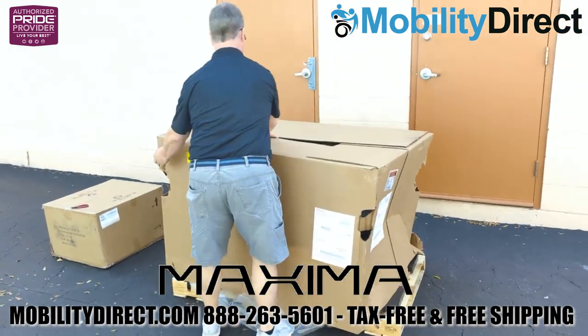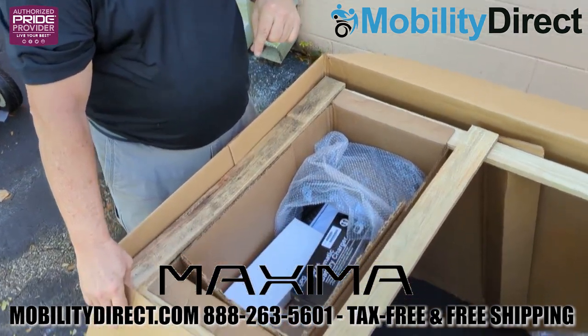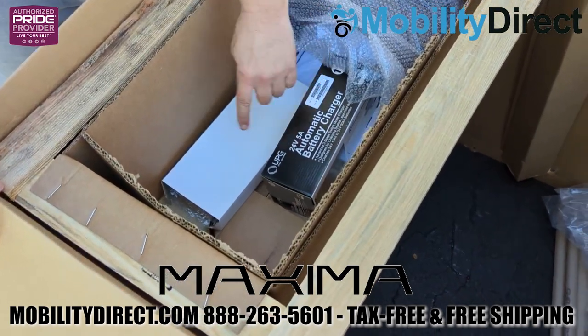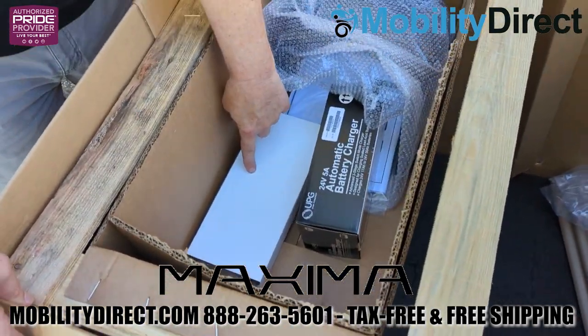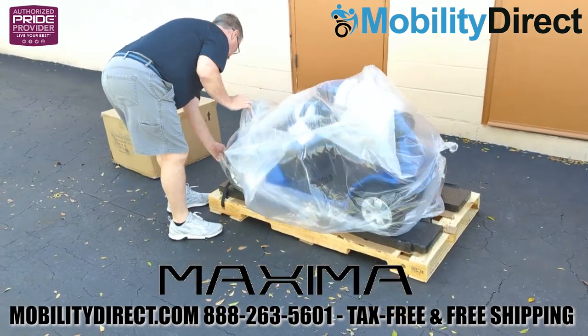When your scooter arrives, it's going to have a very big cardboard box laying over the top. It helps to open up the box and see that there is a separate box on top attached to the wooden frame with your charger, your mirrors, your user manual, and a couple of other things.